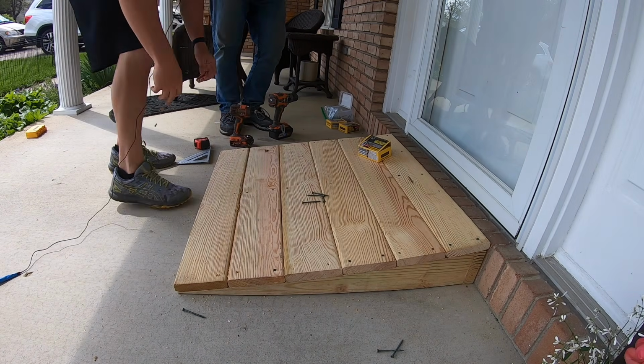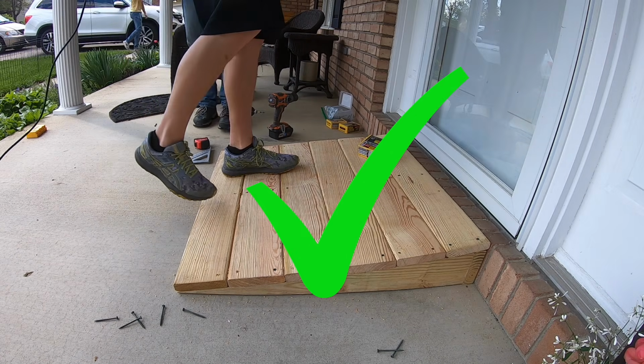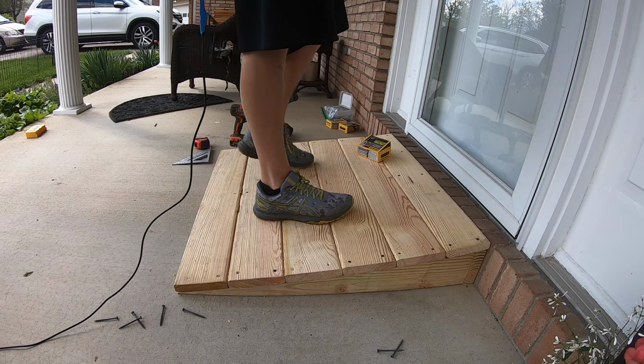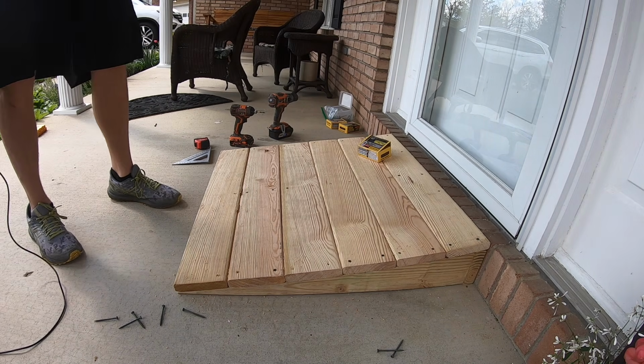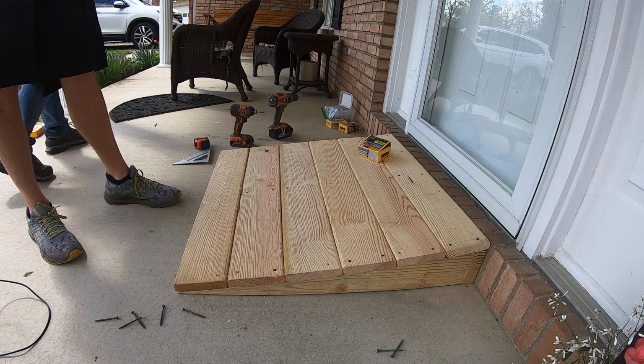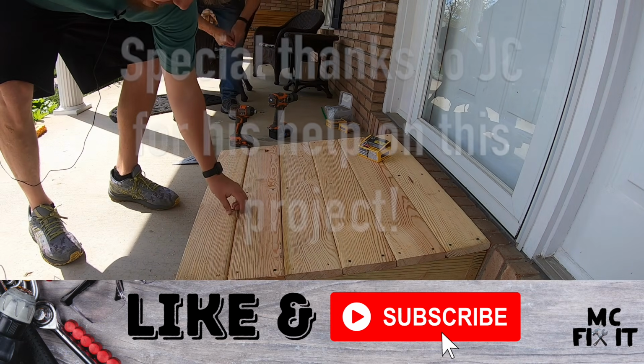Then you do want to make sure that it is exactly what you want. Go ahead and stand on it. Make sure it's not going to move all over the place. Now remember, we'll have just a touch of movement because it is a floating one. It is not locked in. You can always do that if you want, but that is not what they wanted here. So this is the way we're going to go ahead and do that. And that is what you need.